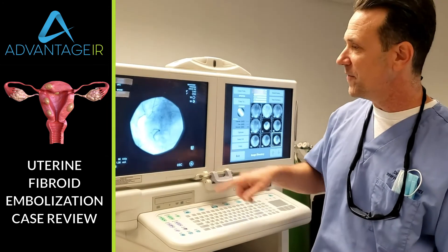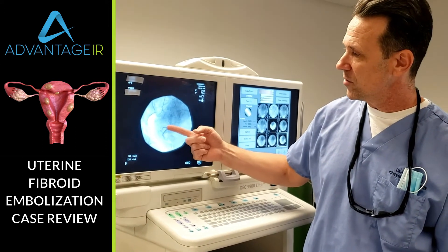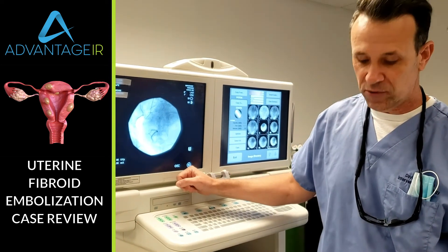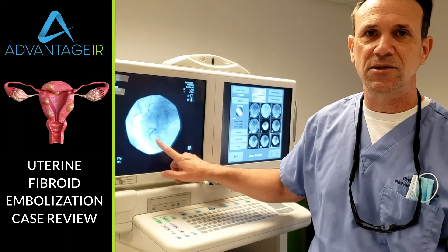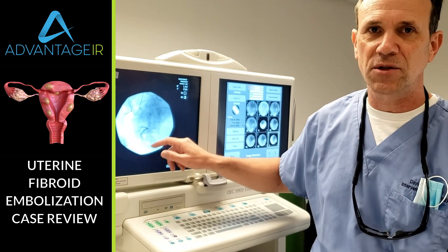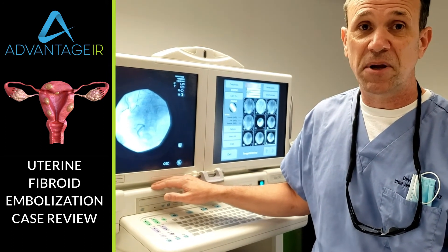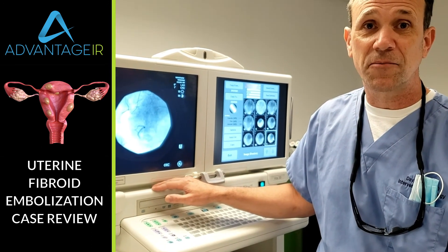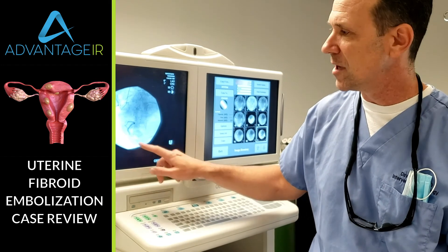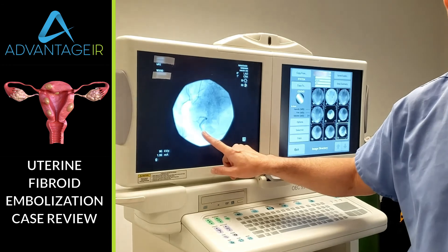As we finish treating the second fibroid from the right uterine artery, you can see this is our endpoint. Now there's pretty much static flow within that right uterine artery, meaning the contrast dye is sitting still with no longer any forward perfusion. There's actually still a trickle of flow going into the uterus, but for the most part the flow has been stopped — maybe a 95% reduction in blood flow into the uterus. This is what we want: to see contrast sitting in the uterine artery for several heartbeats. That's our endpoint.